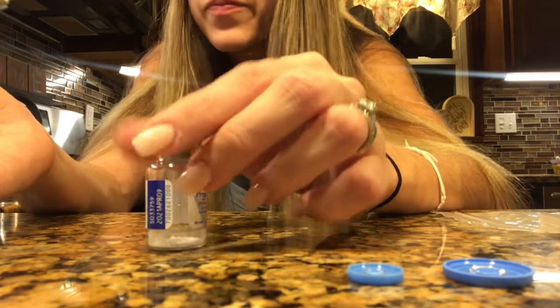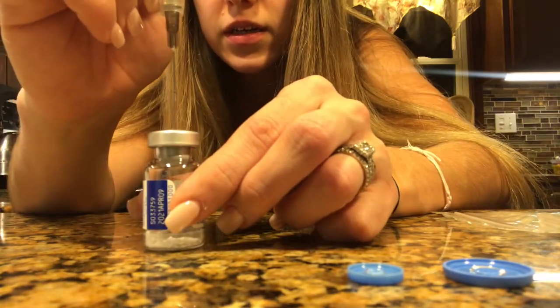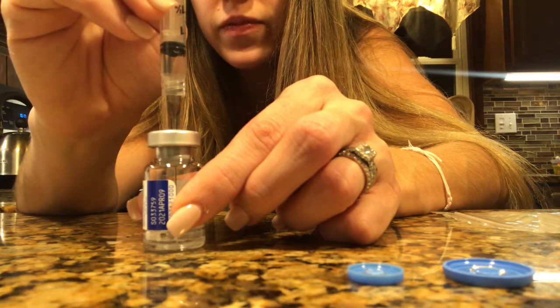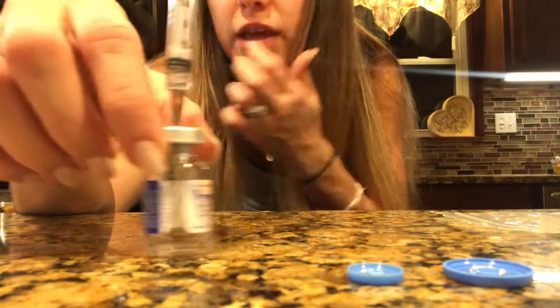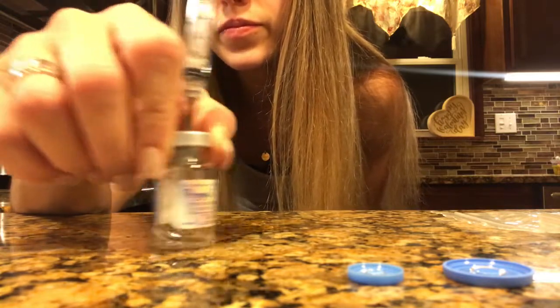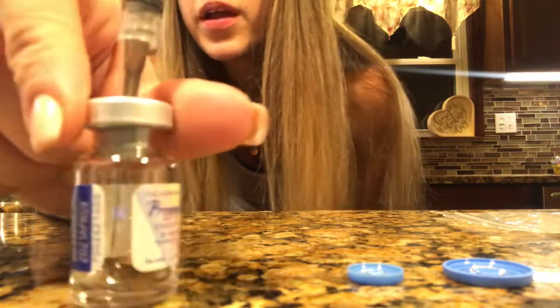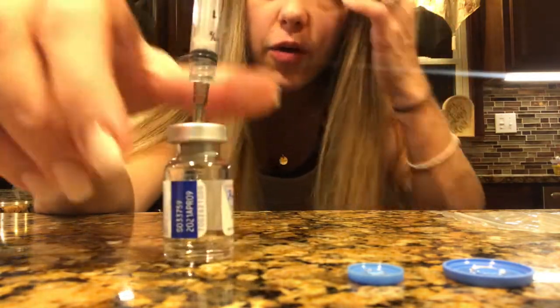I'm going to go a little past it and then push it back up until I get to one, then pull it out. Don't worry about teeny tiny air bubbles in there. Then take the powder vial, insert your syringe, inject the one CC, and shake gently until the powder is dissolved.